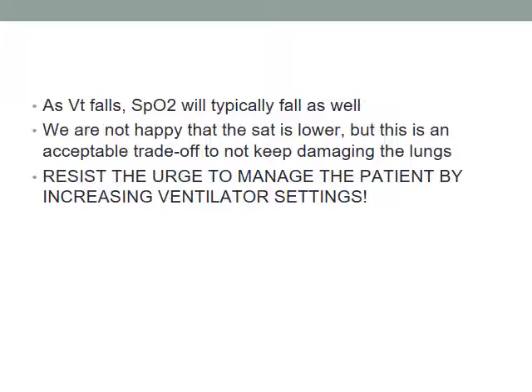Now, if this were a VA patient, where we're trying to get cardiac recovery, and I had an arterial pressure with a MAP of 95, that'd be a medical emergency. We would be putting him on metoprolol or something to get the blood pressure down, or turning down the ECMO flow, or turning down the epinephrine that he's on, or something to try to treat that. In VV, it's no different than a patient with pneumonia.